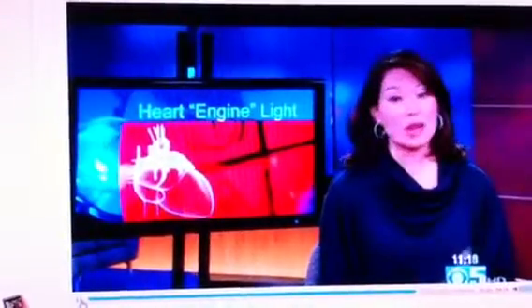Cardiologists say that there are possible complications. Patients could get an infection, the device could fail, or it could penetrate the heart muscle, though that's considered to be very rare. Now, we're still looking at several years before this could be available to the public, but I wanted to show you what it looked like.